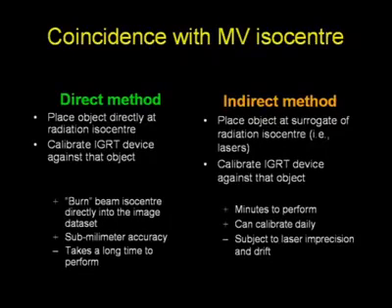However, this method is subject to laser imprecision and drift. As you all know from the AAPM TG40, the expected accuracy of treatment room lasers is of the order of 2 millimeters, and it has been our experience back at the hospital that this is the type of accuracy that we achieve using daily testing with the indirect method.